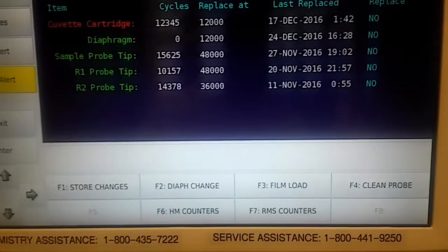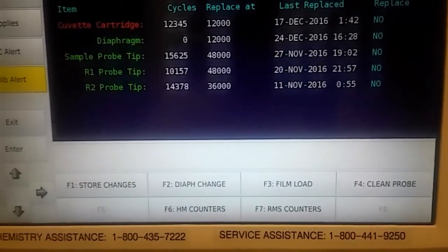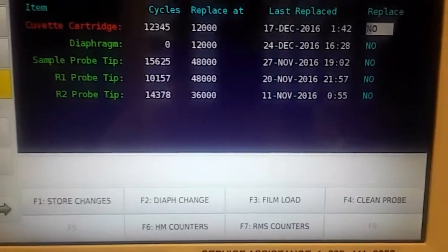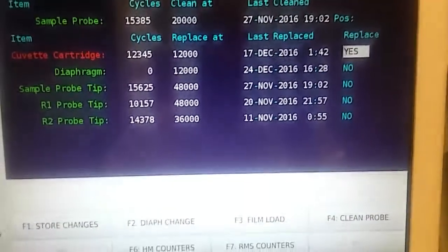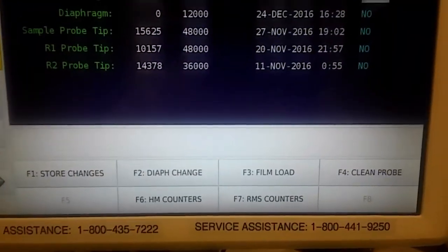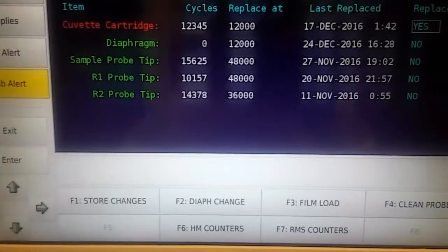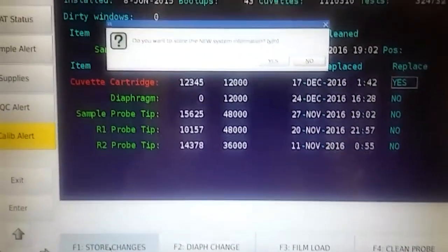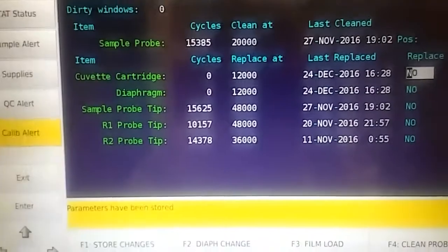Go down and press Enter to replace, then F1 to store changes. Do you want to save the new information? Yes. Now they're both at zero.